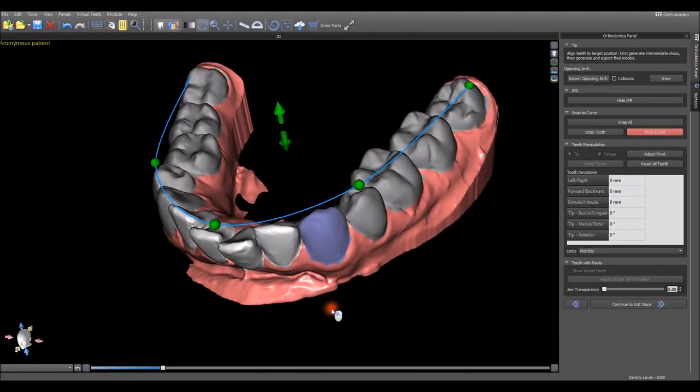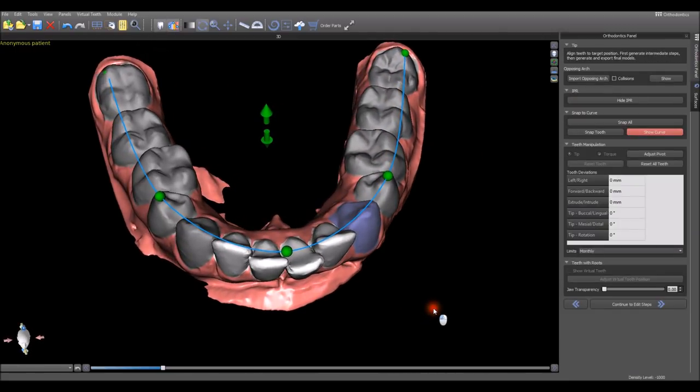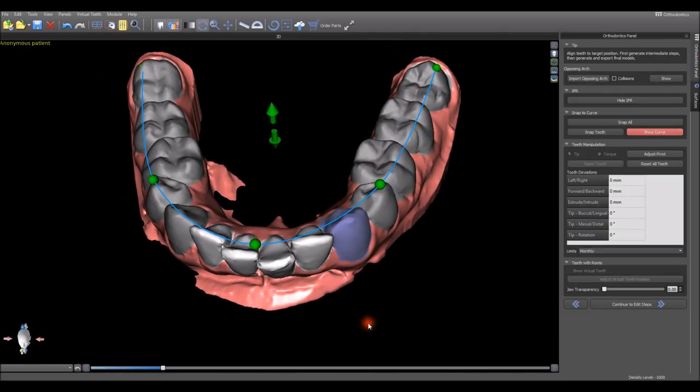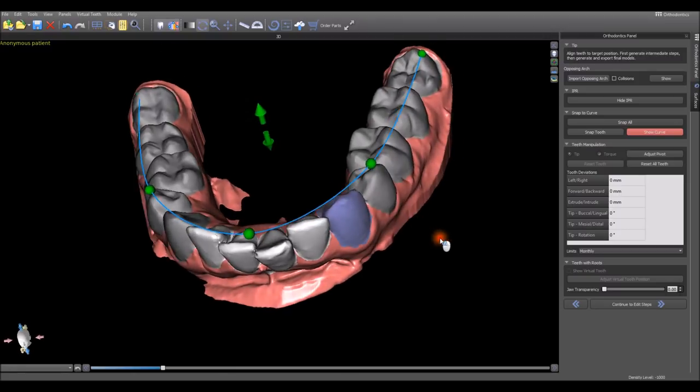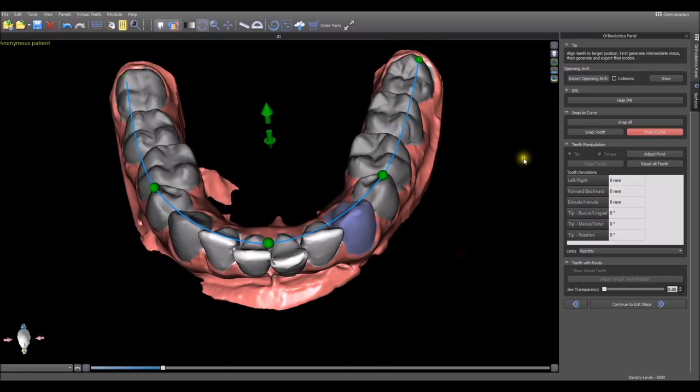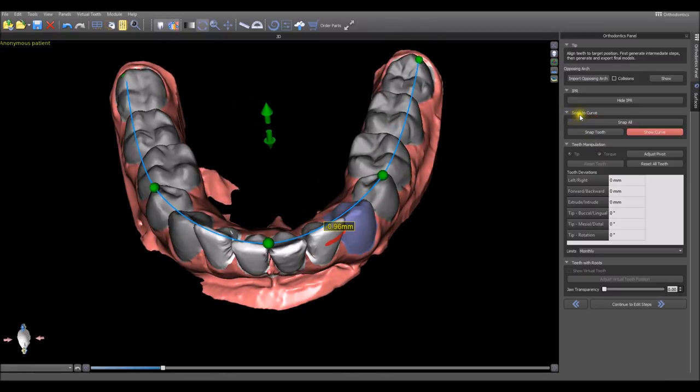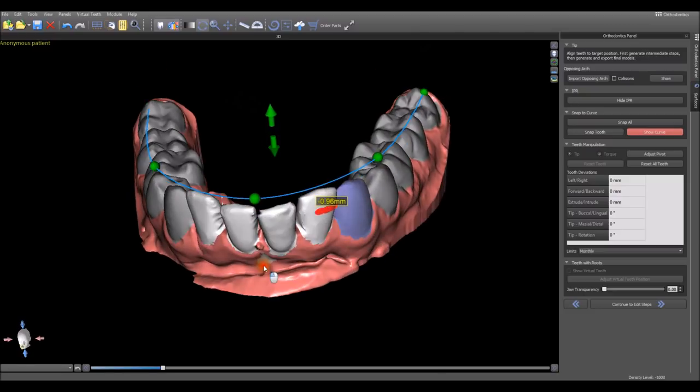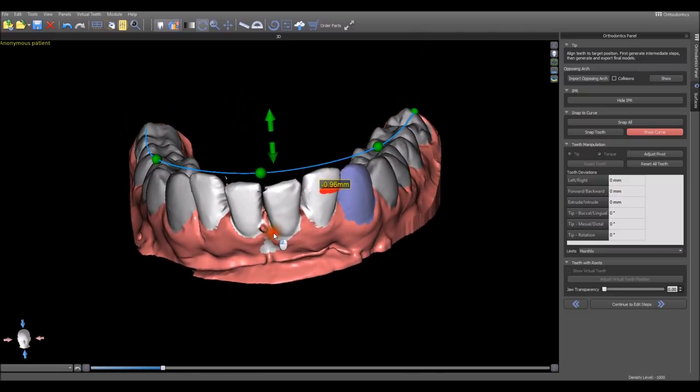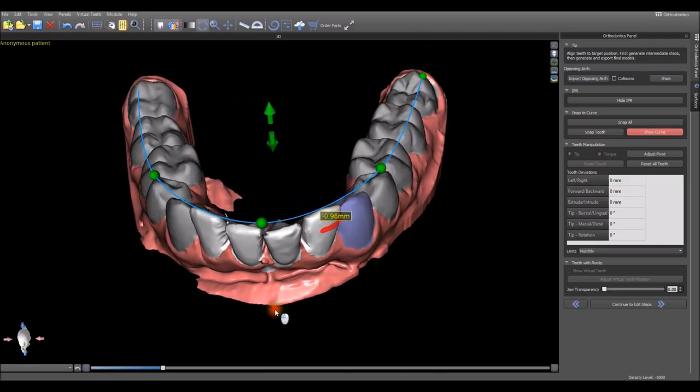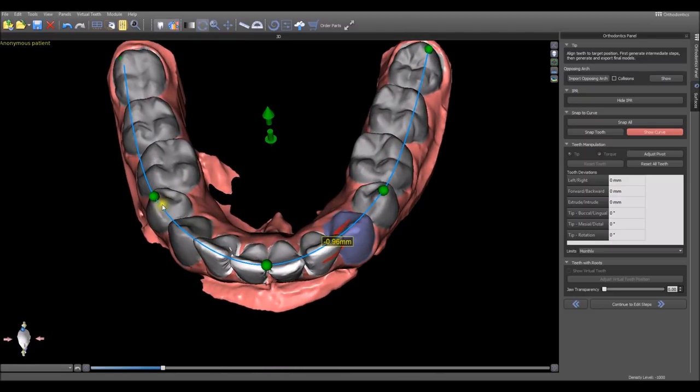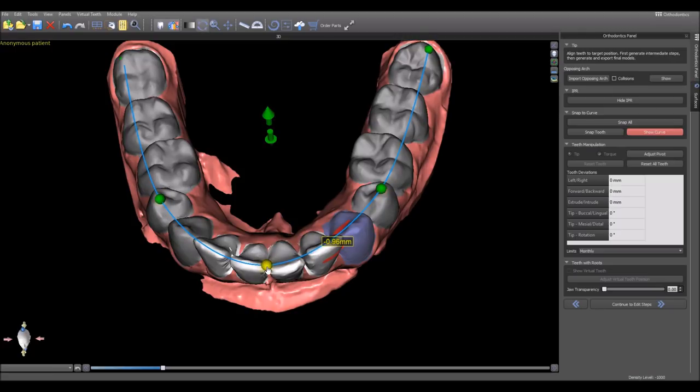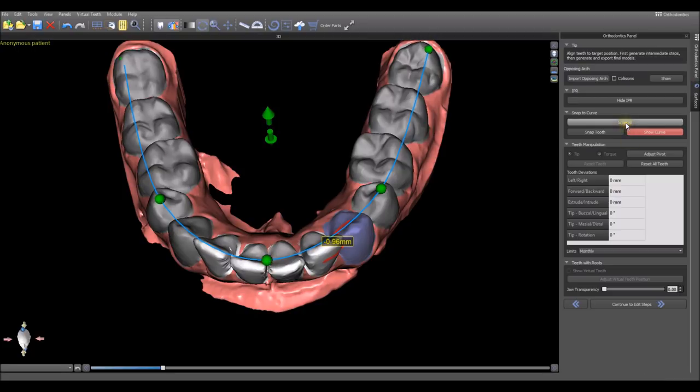The software takes us to the next step. We have an initial placement of a curve running above the teeth. For initial modification, we could simply hit Snap All on the Snap to Curve section, and the software aligns the teeth to the curve. If we want to modify the curve position, we could grab and drag with our left mouse button any of the nodes or circles and re-snap again.